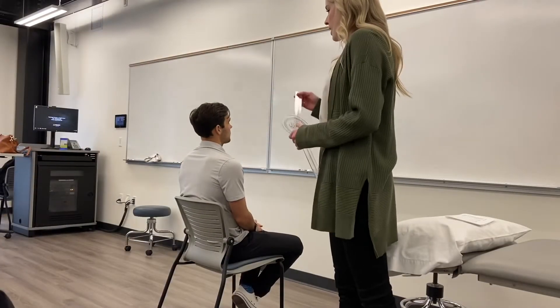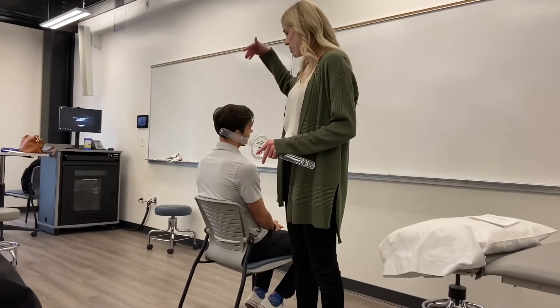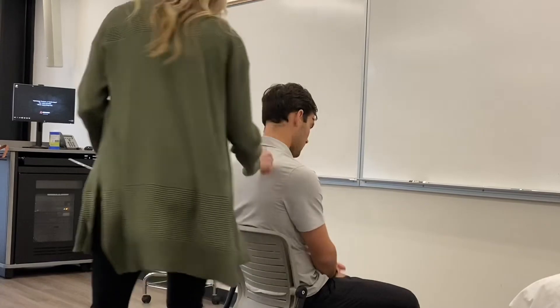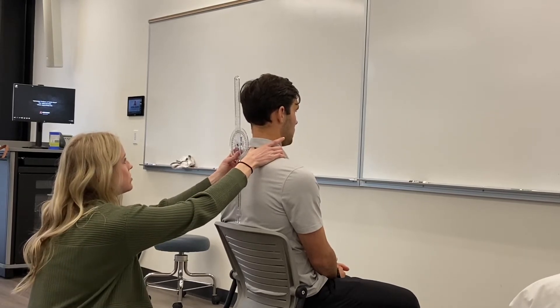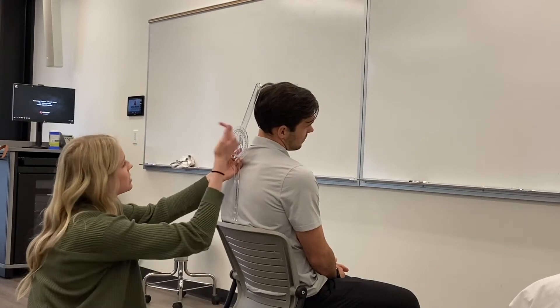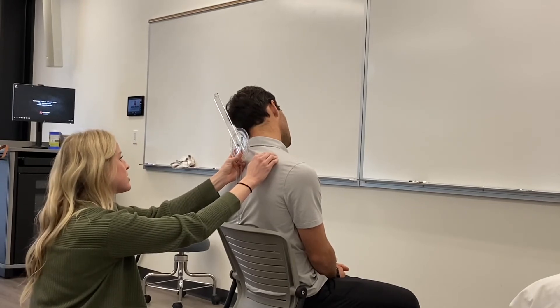The normal range is the same. This is a good opportunity to compare what you get with the inclinometer versus the goniometer. For lateral flexion with the goniometer, your axis of rotation is going to be at the C7 spinous process. Your stationary arm is going to be in line with the thoracic spinous processes, perpendicular to the floor. Your moving arm is going to be in line with the middle of the head — you can use the occipital protuberance as a reference. Go ahead and bring your head to the right. He gets 35 degrees; normal is 45. Then the other way — he gets 40 degrees.